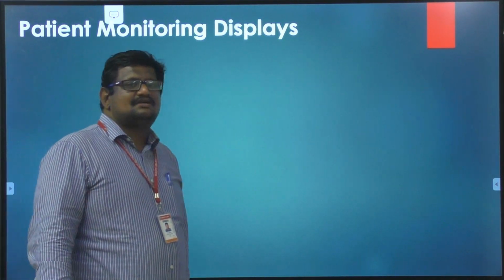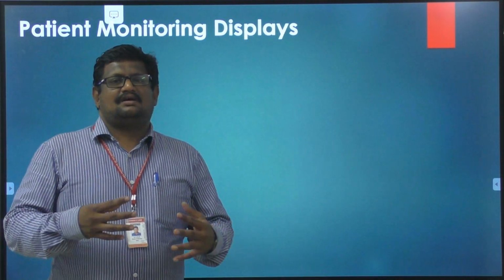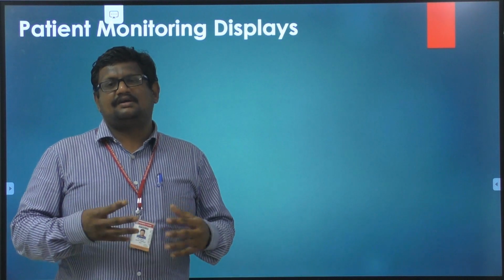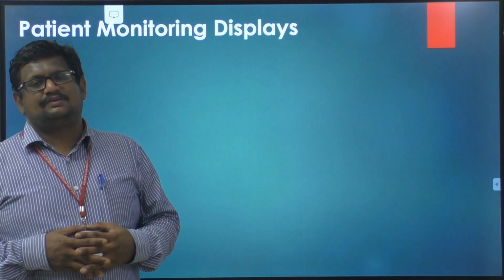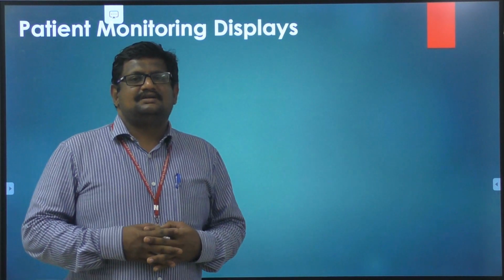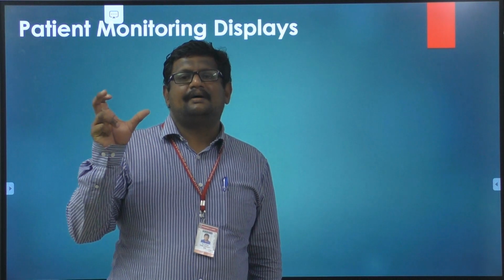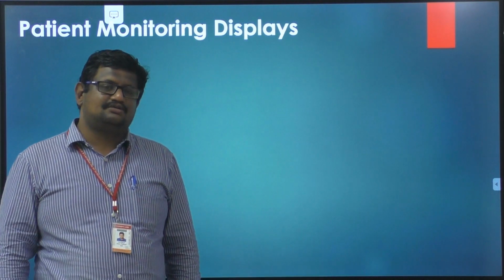Regarding the displays also we need to study. There are non-fade displays and fade displays. General types of displays, the olden days or preliminary types of displays, are those where you can see a dot going as a signal. We have to trace the dot to understand the signal. Recently non-fade displays have come that will not fade for a particular period of time. For example, for 1 minute the display is able to hold the particular waveform. That is called a non-fade display.